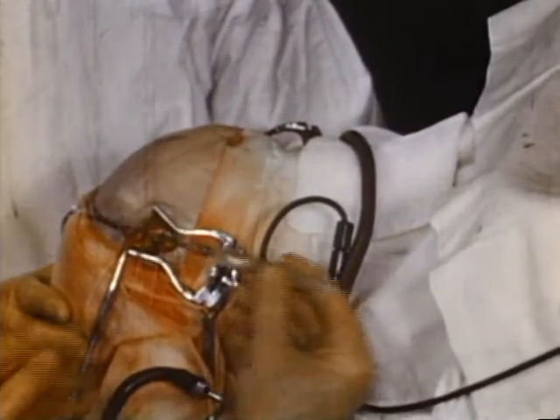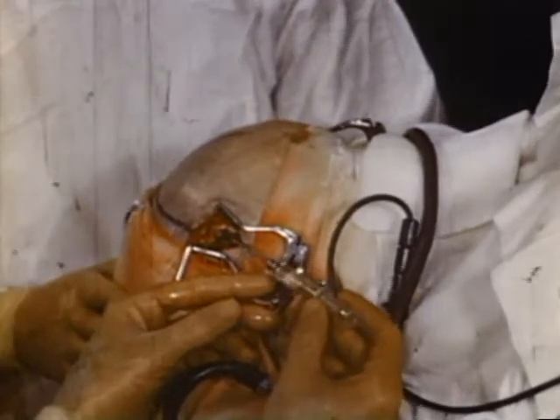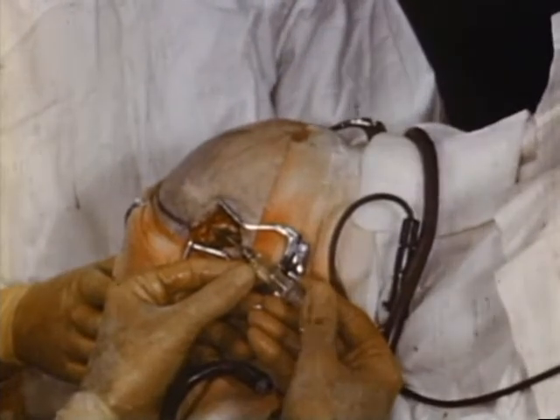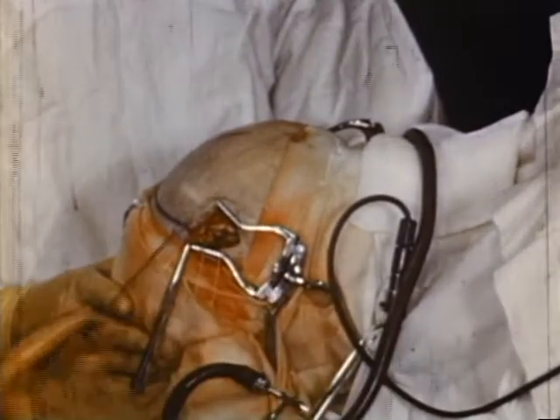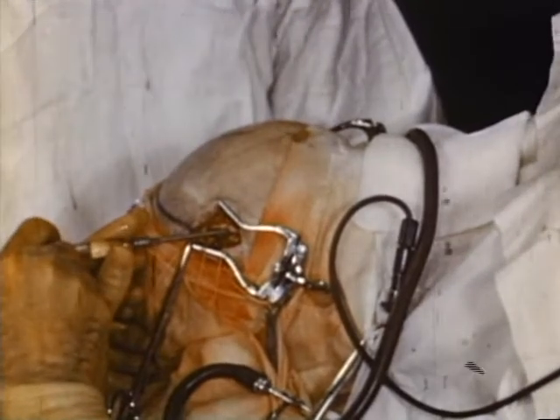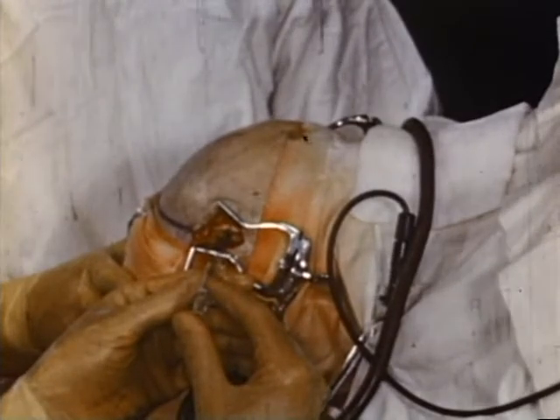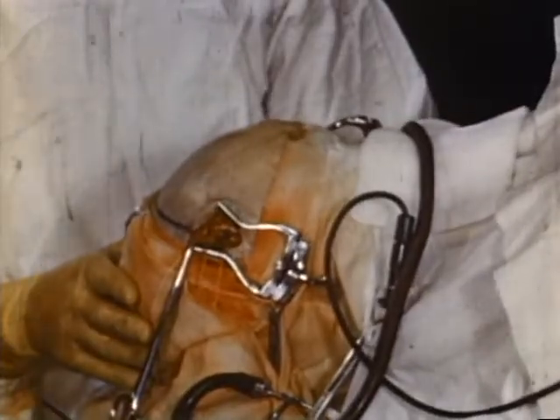When the operation has been completed on both sides, the surgeon injects a few drops of iodized oil into the upper and lower extremities of the incisions in order to demonstrate by X-ray their exact location. This is of importance, since a failure of the operation can often be correlated with the erroneous placement of the incisions.